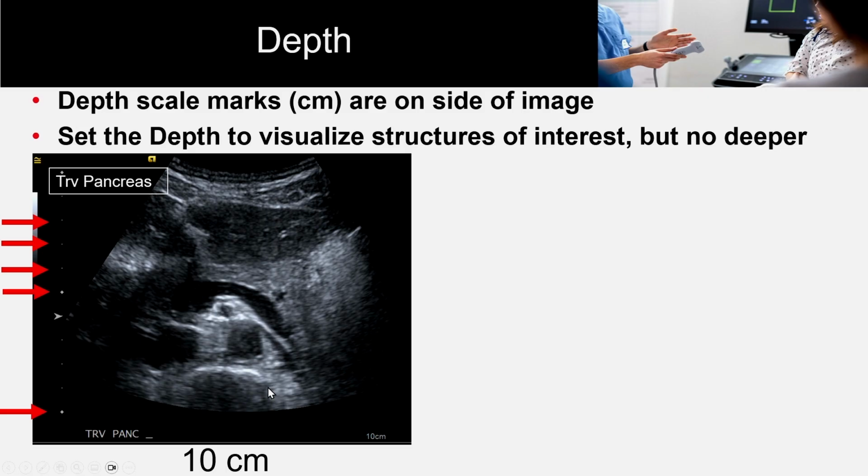This is a thin patient. You have the rectus abdominis muscle with overlying skin and subcutaneous tissue. You have the greater omentum. You have the left lobe of the liver, segments 2 and 3, falciform ligament coming down. You see the splenic vein coming across in the portosplenic confluence, superior mesenteric artery, aorta, IVC, pretty nice view.